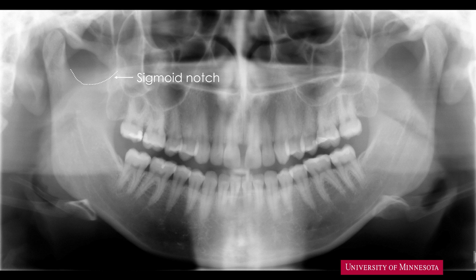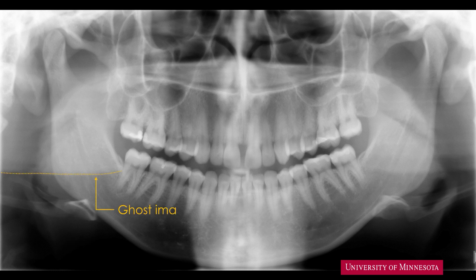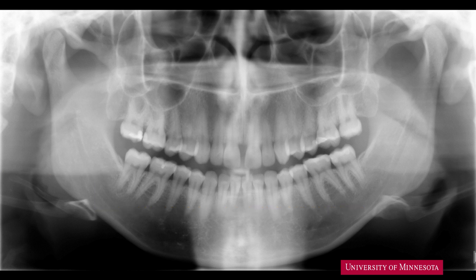The linear entity near the angle of the mandible is the hyoid bone. On the left side, you may also identify the hyoid bone — so the hyoid is recorded twice on the panoramic radiograph. There is a horizontal line of contrast extending past the right ramus — this is the ghost image of the inferior border of the left mandible. Now that we know the sigmoid notch, we can continue further mesially and identify the conical structure — the coronoid process.